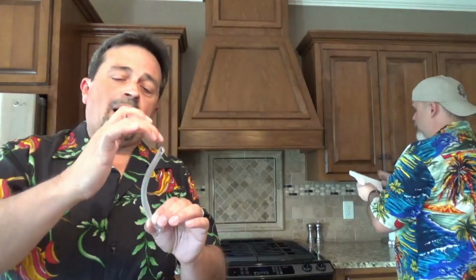Yeah, so whenever you do this, a lot of the time as you're scraping across the turbinates, you're going to get a little bit of nosebleed. Don't freak out about that. But at the same time, don't pound into it, because if you do tear tissues, you can have a whole lot of nosebleed and even more airway issues.